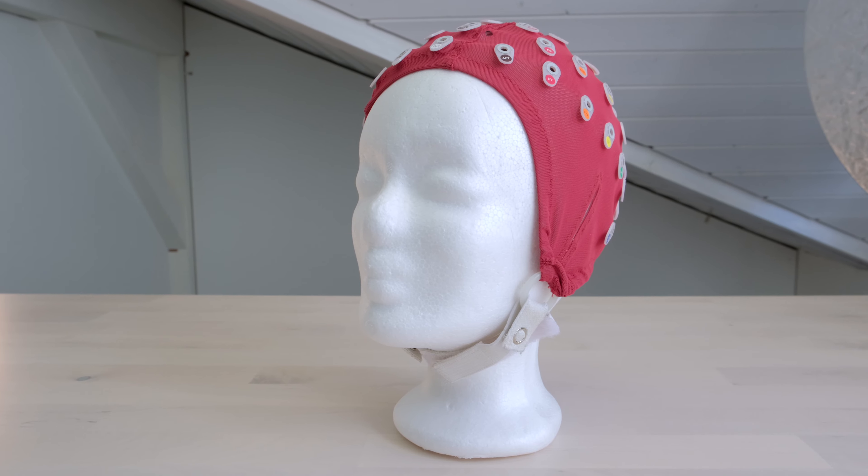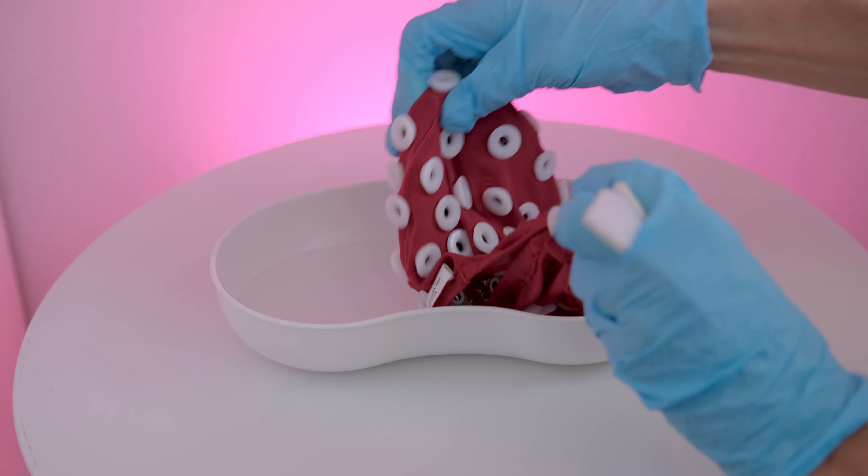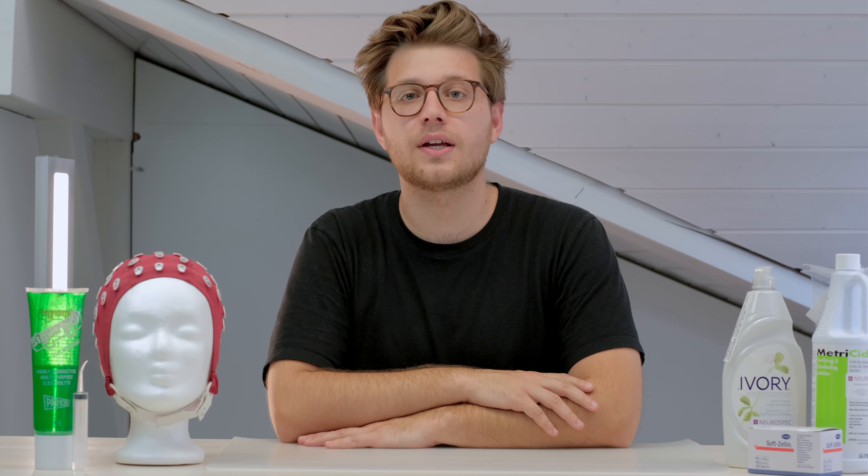For the cap, remove the chin strap and wash it with soap — we recommend Ivory soap — under hot water, using a soft brush to remove any residual gel. Leave it in alcohol for up to five minutes, then take it out, dry with a soft clean towel, and hang to dry.